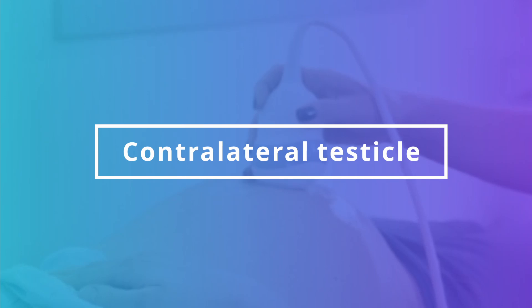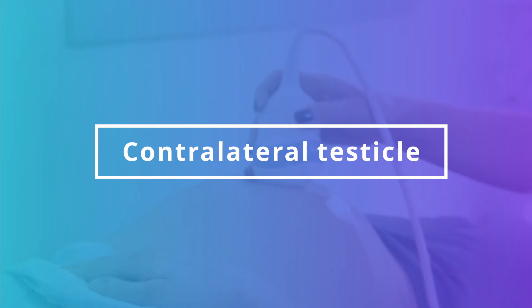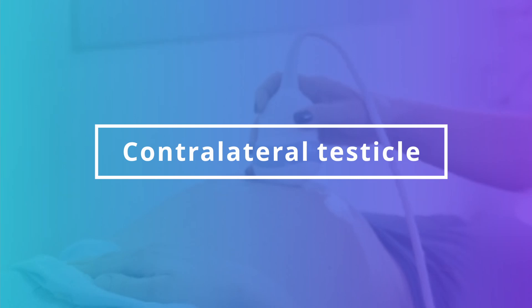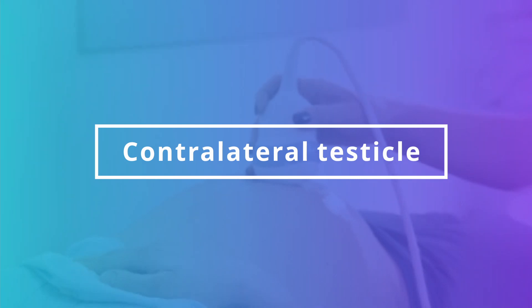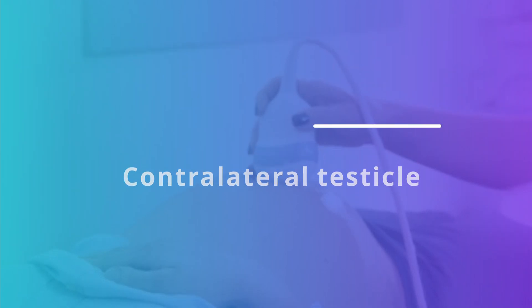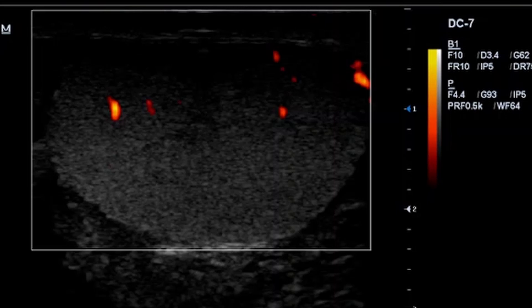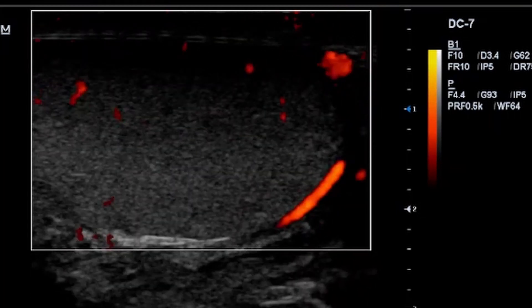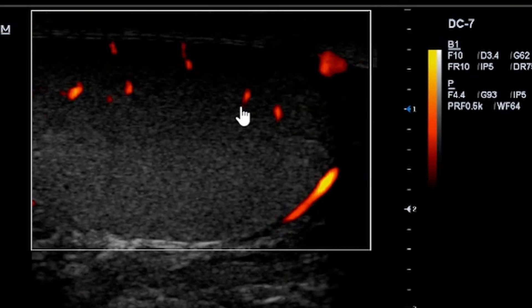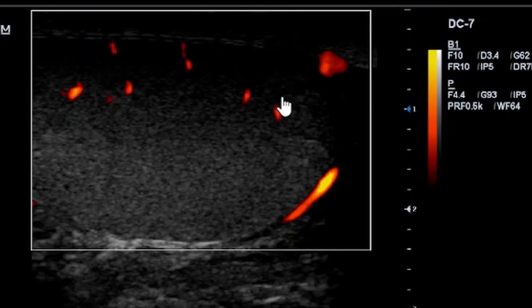When doing an ultrasound scan, God duplicated some of the organs that we have. So to be sure that what you are seeing is a pathological process and not something normal, you have to compare with the contralateral side. We do have two testicles. The affected testicle was the right; now we have the left testicle. You can investigate the testicle on power and color Doppler. Here is power Doppler — you can actually see perfusion: there is peripheral perfusion and there is intra-testicular perfusion, shown in red on power Doppler.